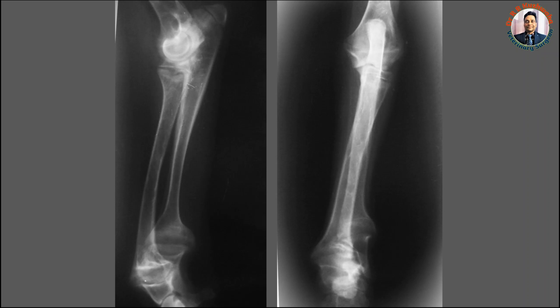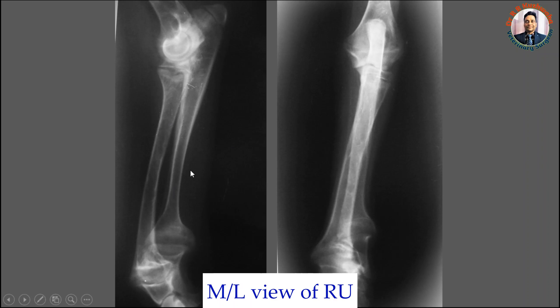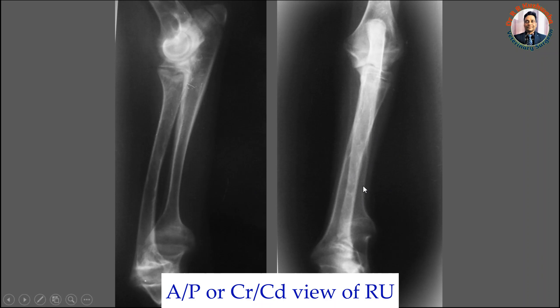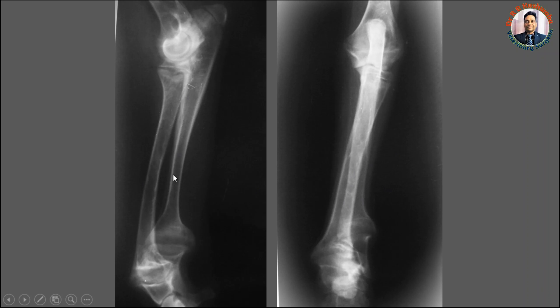Today I am going to describe the radiographic features of a dog suffering with rickets. You can see here, this is the mediolateral view of the radius and ulna, whereas this one is the anterior-posterior view, or craniocaudal view. In this particular radiograph, I am going to describe the normal radiographic anatomy and then where the abnormality is seen in case of rickets.